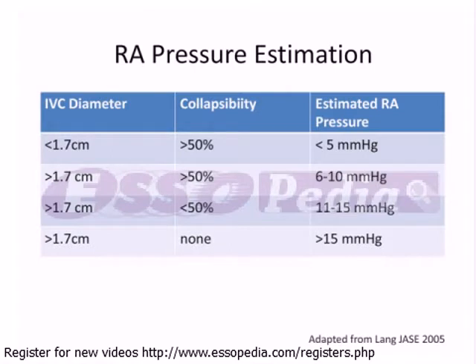In the ICU setting, there are a number of differences with our usual echo evaluation. Firstly, many patients are being ventilated with positive pressure ventilation. The IVC in this setting is usually dilated. In fact, if the IVC collapses during the respiratory cycle, it may represent hypovolemia. Secondly, in many patients, a right atrial line is available, which can be transduced to directly measure the right atrial pressure. This method is preferable when available.